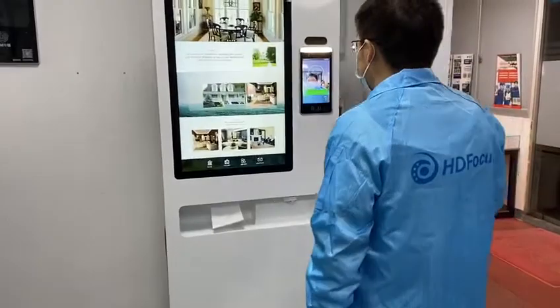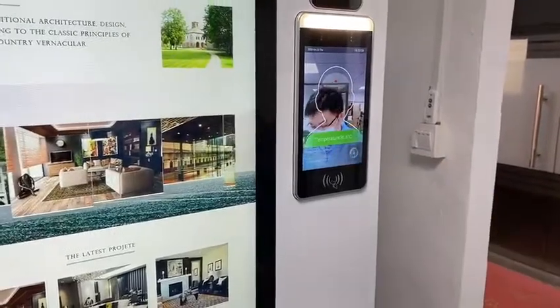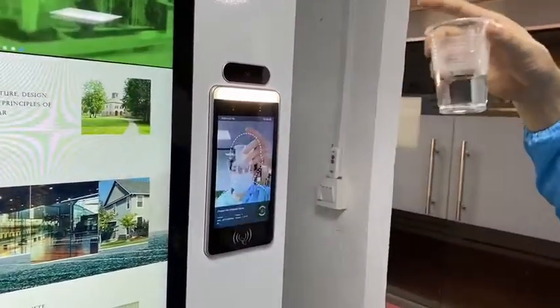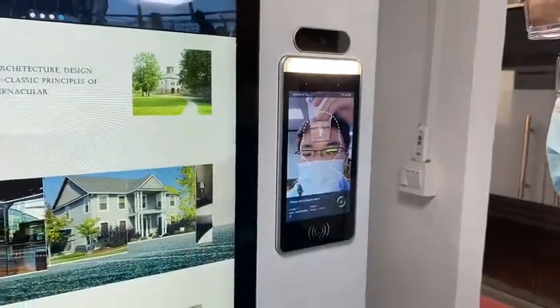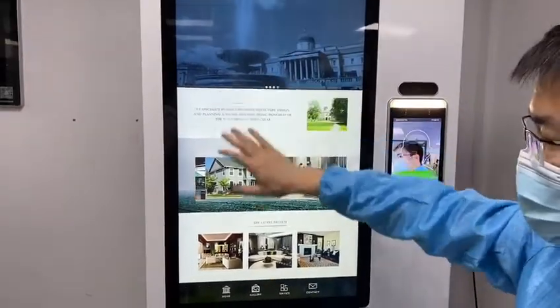First, I test my body temperature. My temperature is normal, so it shows green. In case a person's temperature is not normal, I put hot water here to simulate it, and it says alarm — abnormal. It's very accurate.